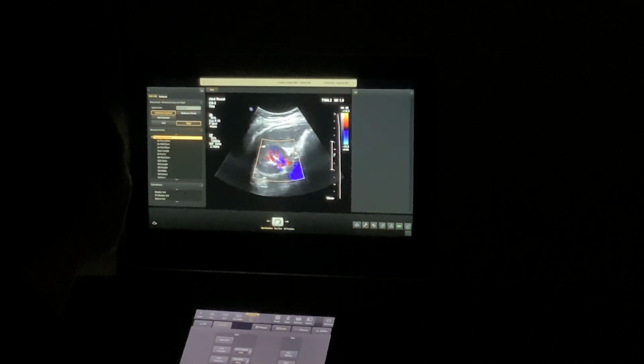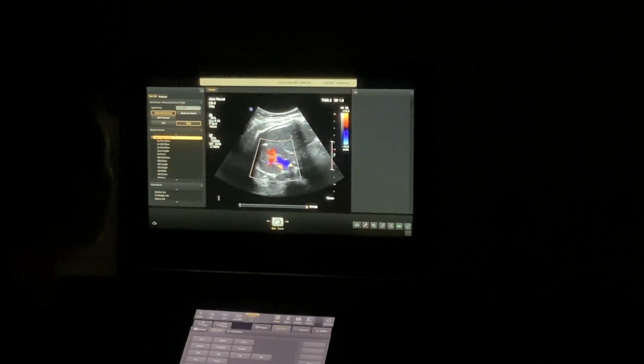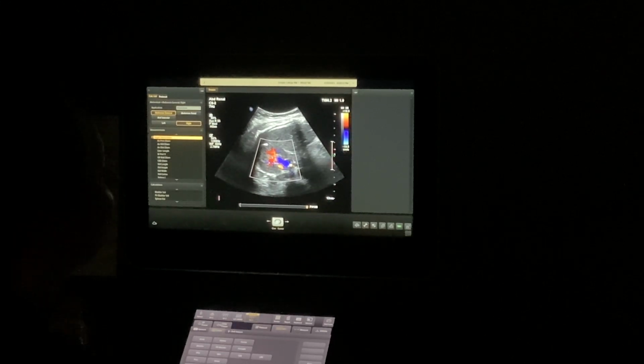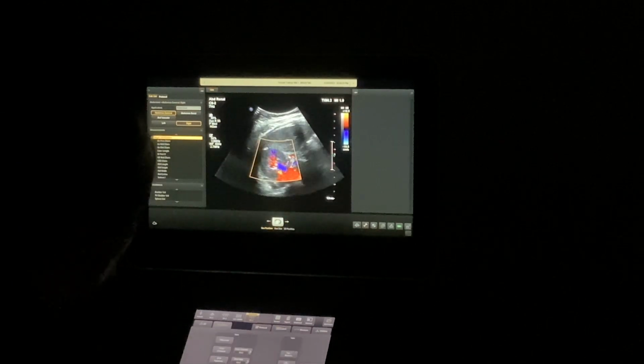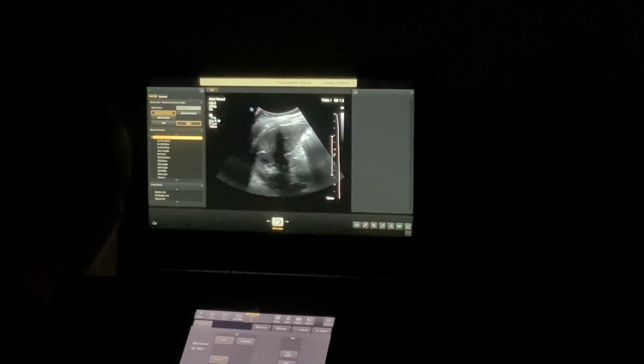Small breath. Gas, go away. Breathe. And I want to see that color going into the hilum, coming from the outside of the kidney, going into the kidney. And that is a much more acceptable box size. Okay. Any questions so far on that? No? All right, deep breath.